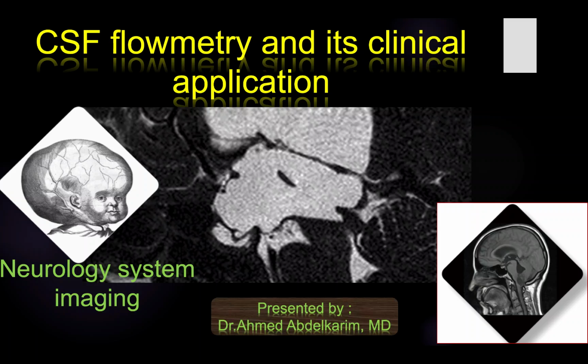Many of our colleagues have asked me to repeat this lecture, which is about CSF flowmetry and its clinical application. And I think it is one of the most important lectures in our radiology course. So I will repeat the lecture today in English, and I will discuss some important cases that directly apply CSF flowmetry, and how we can apply this CSF flowmetry in real-life clinical practice at the end of the lecture, inshallah.